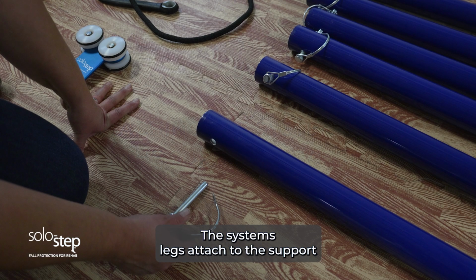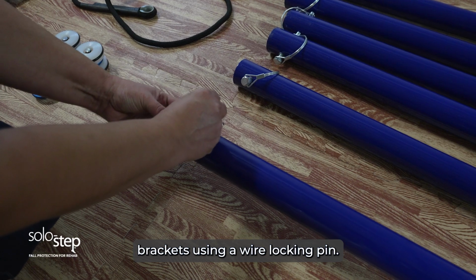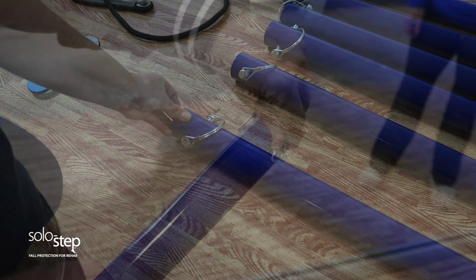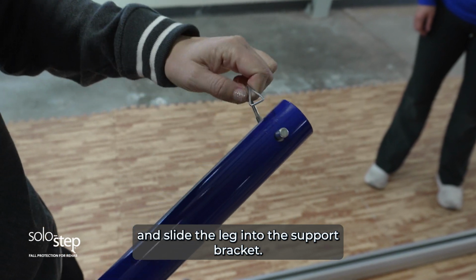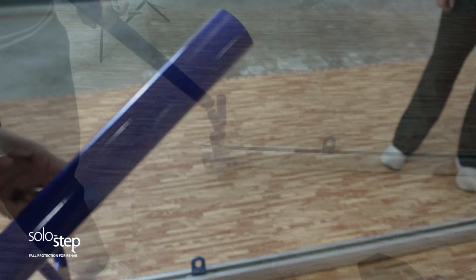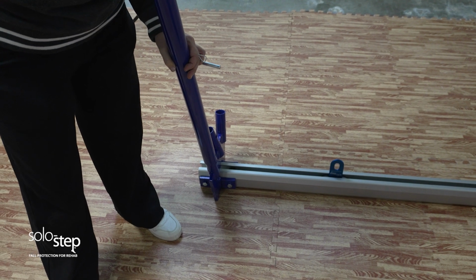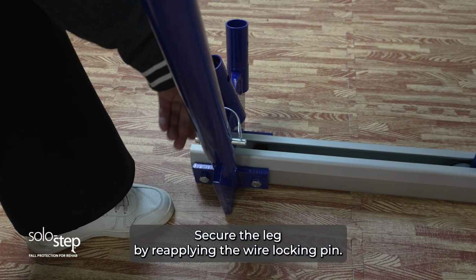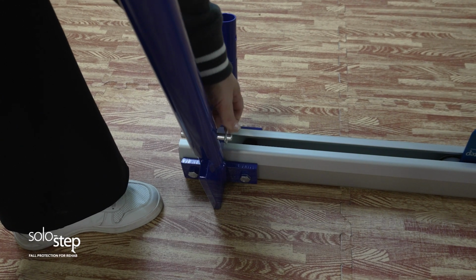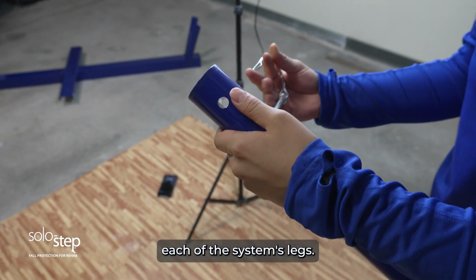The system's legs attach to the support brackets using a wire locking pin. Simply detach the pin from the leg and slide the leg into the support bracket. Secure the leg by reapplying the wire locking pin. Repeat this process for each of the system's legs.